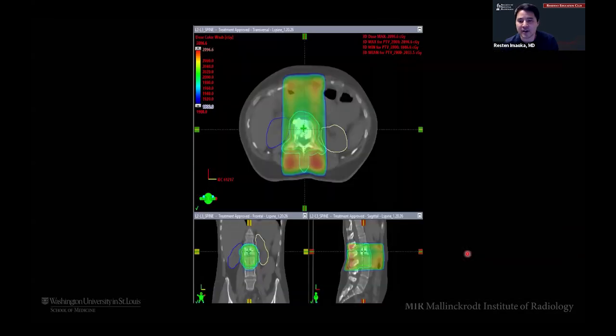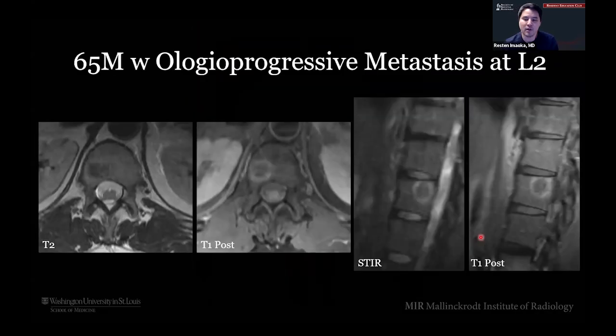And again, a lot of these patients are treated with rad onc at the same time. So this was just what their mapping kind of looks like. You can see how they conform their radiation to the vertebral body. And this person ended up getting 20 gray. So that's kind of how that works. We'll just go over now kind of the procedural steps of how you would do ablations.